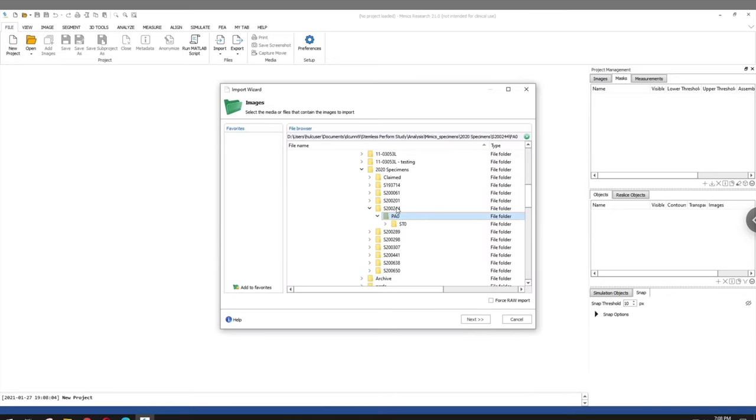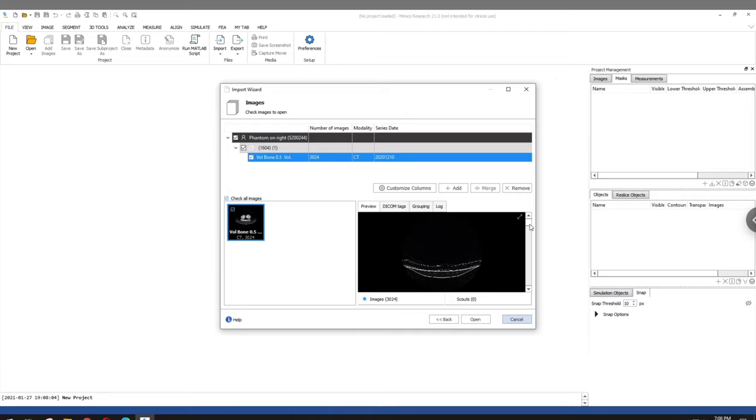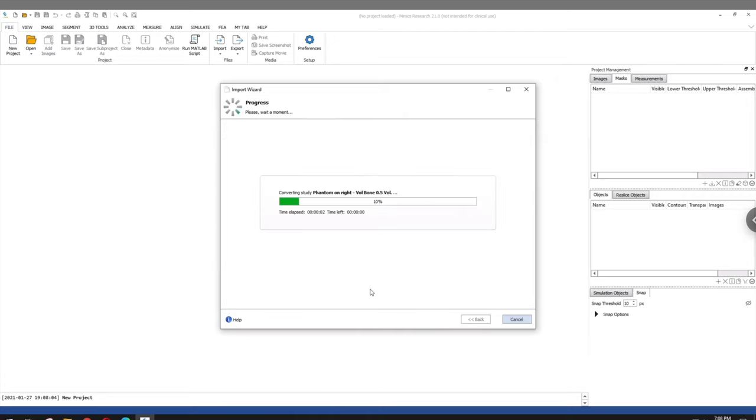If you have your DICOM images available, just click on New Project and open up the folder that contains all of your CT DICOM images, and it should open up relatively easily, if everything's set up right.